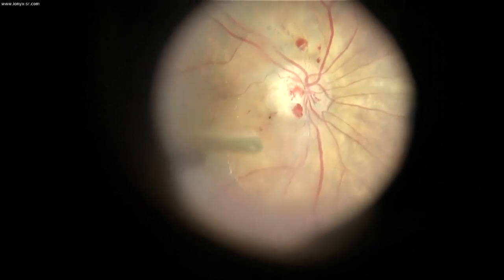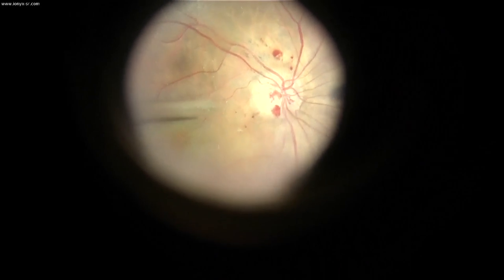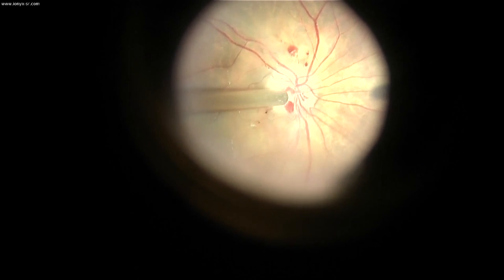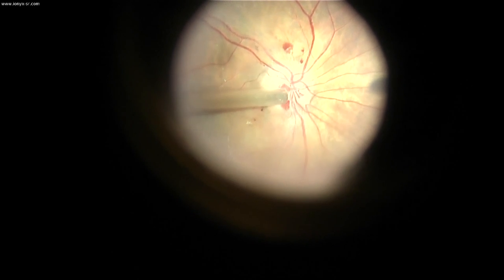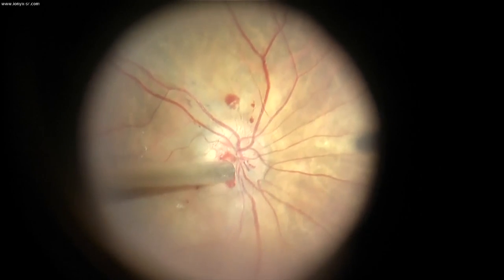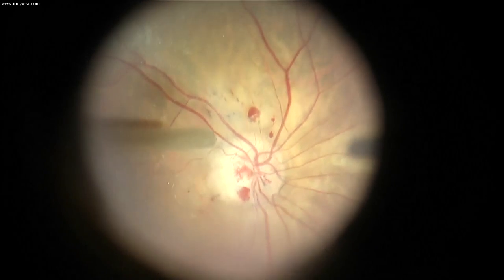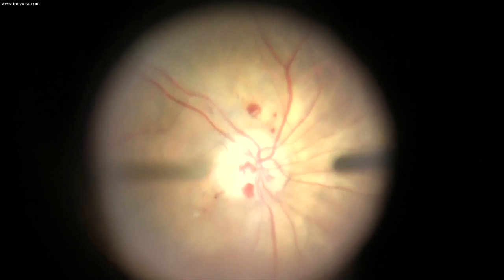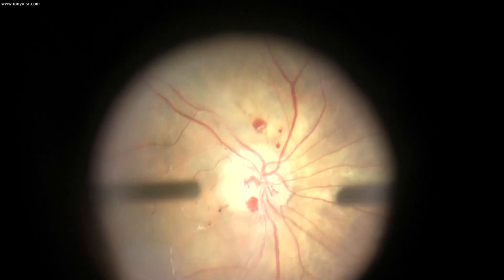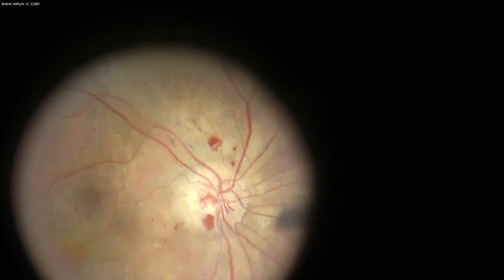I think yes, because I have stained with brilliant blue. I have peeled the ILM centripetally from here to the optic nerve. And then I have peeled some blue material that was in front of the major vessels. Of course, now I'm afraid to do too much. So I had some bleeding, so I'm playing with the infusion pressure. I still have some minor staining in the middle at the crossing of the major vessels. Okay. So I will do the last attempt, and then I think I will stop and see what happens.